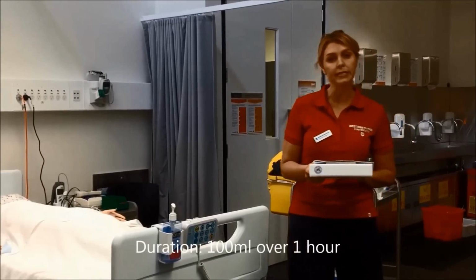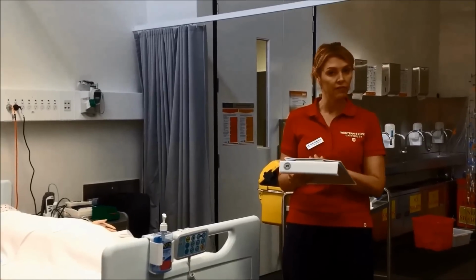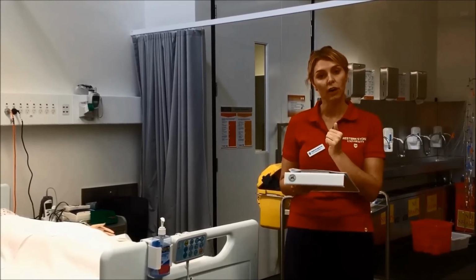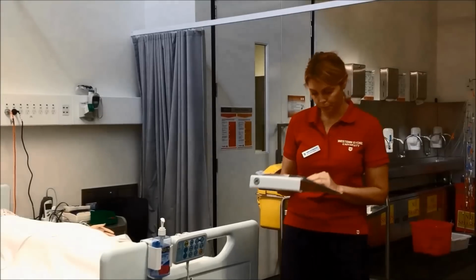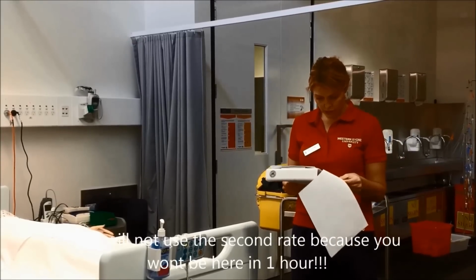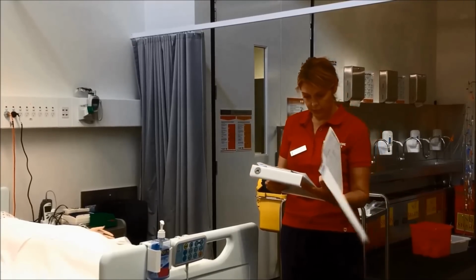So if he's going to commence the IV fluids, I might as well use a burette, put the 100 mils that I'm going to give my gentamicin in the burette and give it that way. Then after I've done that, I will recommence the IV infusion at the rate that's on the IV fluid order. Okay, all right. Normal saline. So it's 500 mils, but I'm going to put in 100 mils, and there's the order.